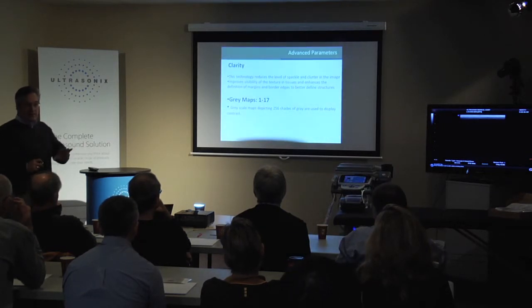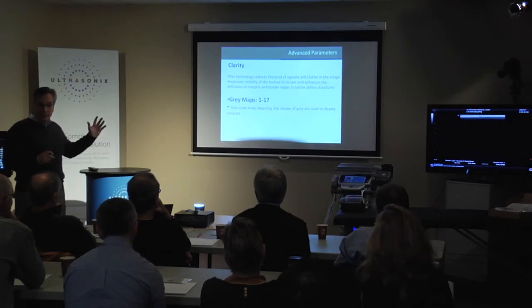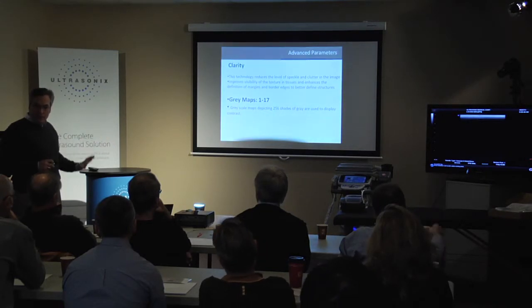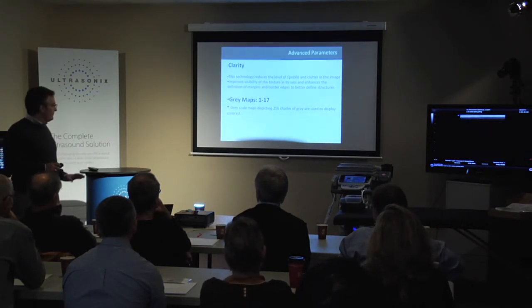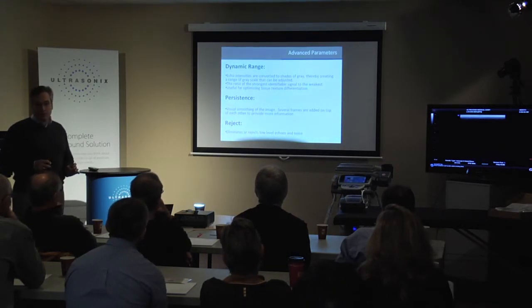This may be getting into some of the minutiae of the sonography, but I'm only sharing this with you so that if you're so inclined to want to look at this further, they're available to you as an image choice for optimal system operation. Dynamic range, persistence, reject, these are all additional things that are commonly used for sonographer or radiology manipulation as well.